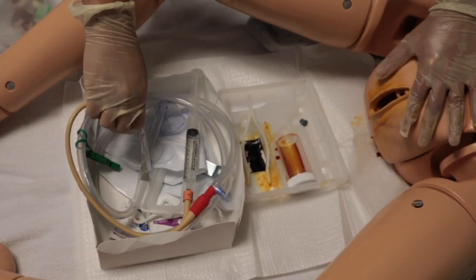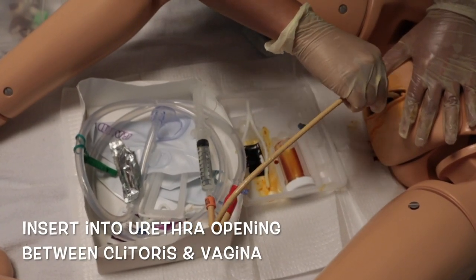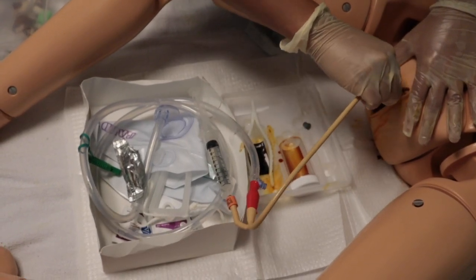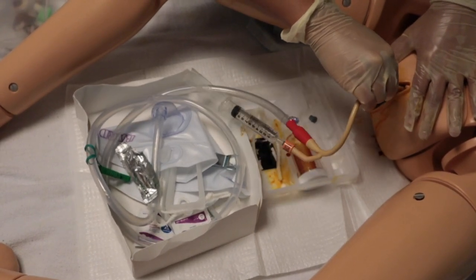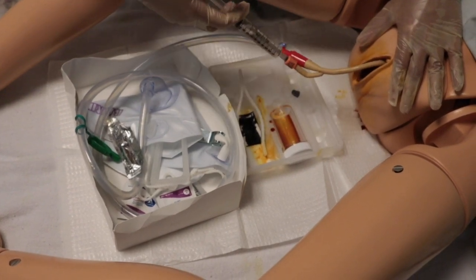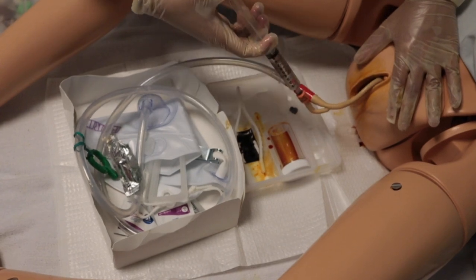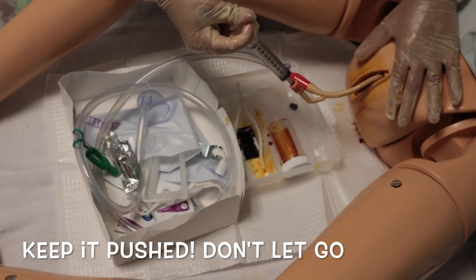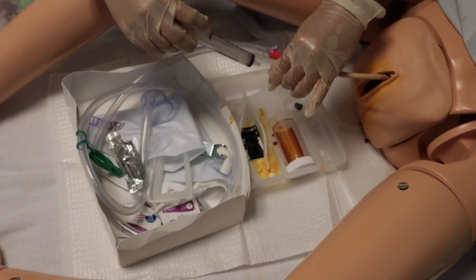Grab the lubricated rubber catheter, insert it into the urethra opening, located between the clitoris and the vagina, then carefully advance. If you meet resistance, don't force the catheter in because that can cause trauma to the area and pain for the patient. Once you see urine draining into the bag, then advance 1 inch in to ensure you are fully in the bladder. Inflate the balloon by pushing the syringe plunger. Keep it pushed. Give the outside catheter a little tug to make sure it stays in. Then disconnect the syringe.